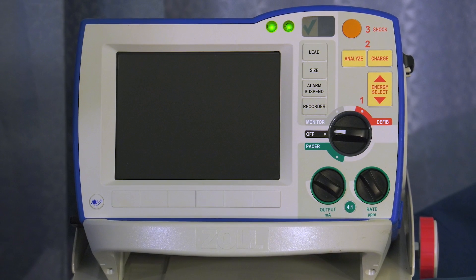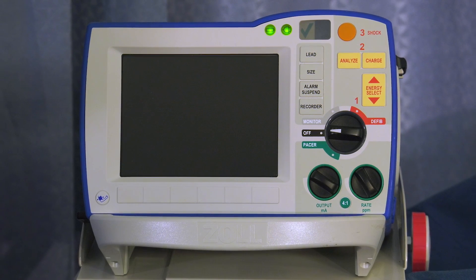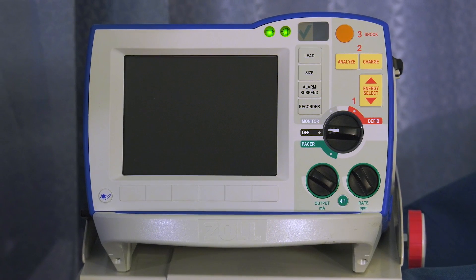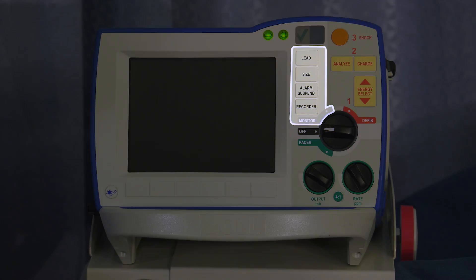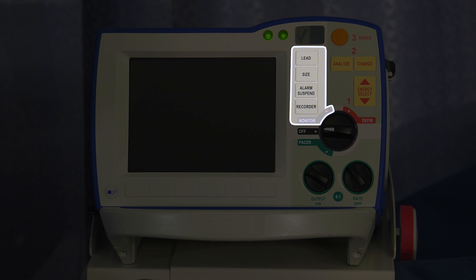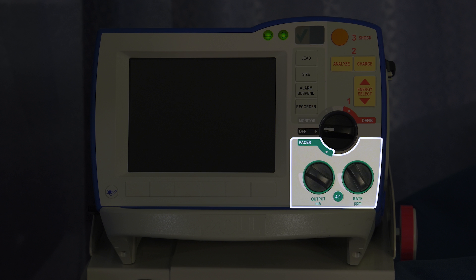The R series promotes ease of use with the uniform operating system. All critical functions begin with this one main dial and are color-coded for ease of use. The gray zone is for monitoring your patient. The red zone is for defibrillation. The green zone is for pacing.